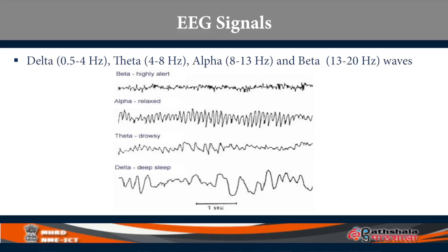Basically, the highest level, the beta waves, are elicited when we are conscious and engaged in higher cognitive functions like thinking, reading, writing, speaking, and that kind of thing. So obviously, in neurolinguistics, we are more interested in monitoring these beta waves.